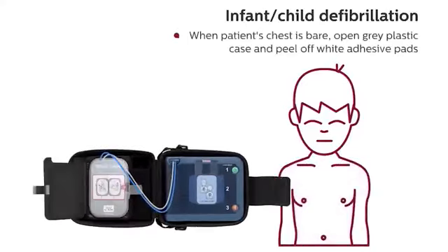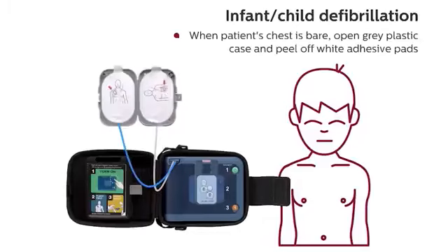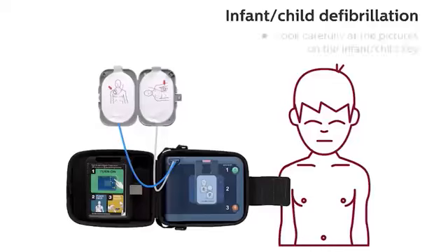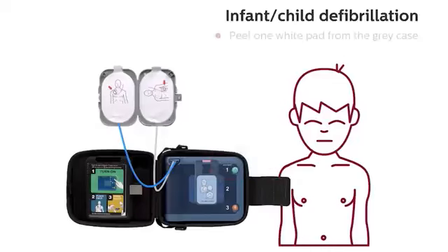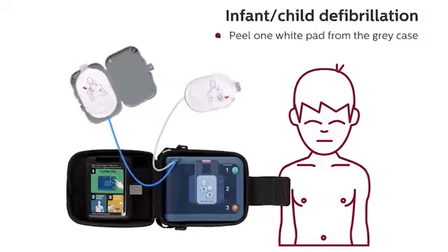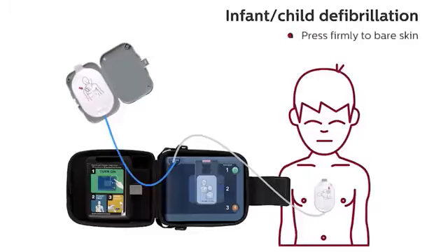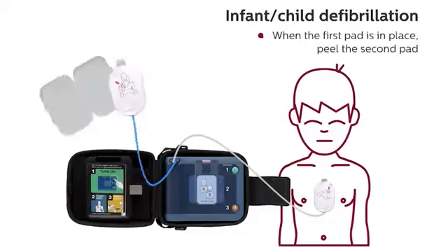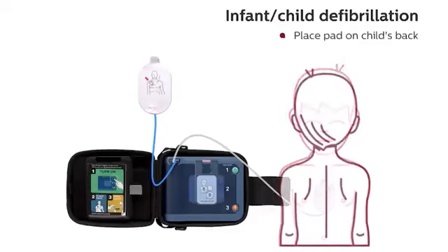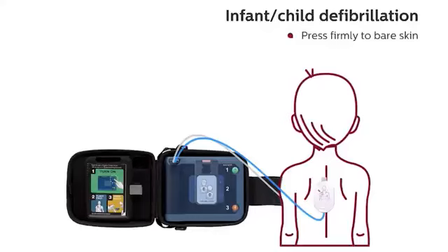When patient's chest is bare, open the gray plastic case and peel off the white adhesive pads. Look carefully at the pictures on the infant child key. Peel one white pad from the gray case. Place pad in center of child's chest and press firmly to bare skin. When the first pad is in place, peel the second pad. Place pad on child's back and press firmly to bare skin.